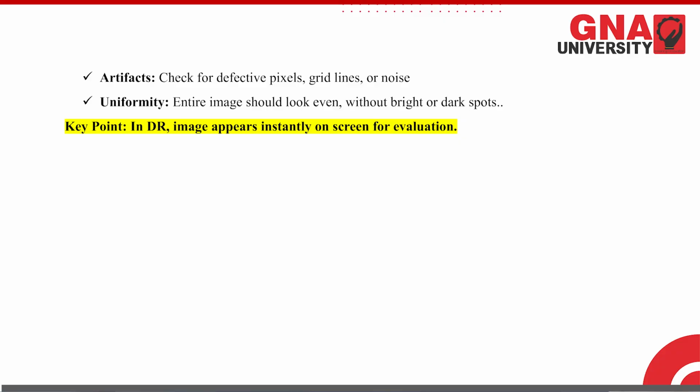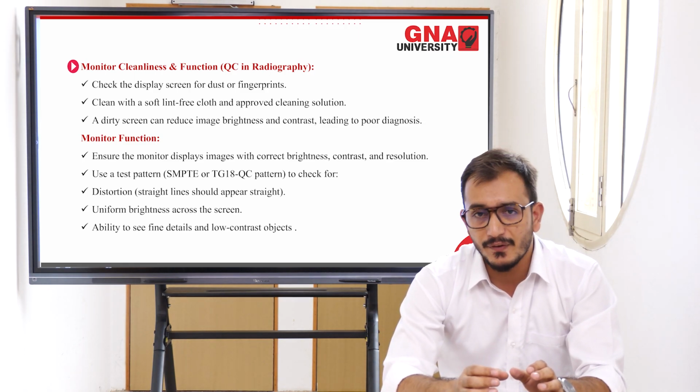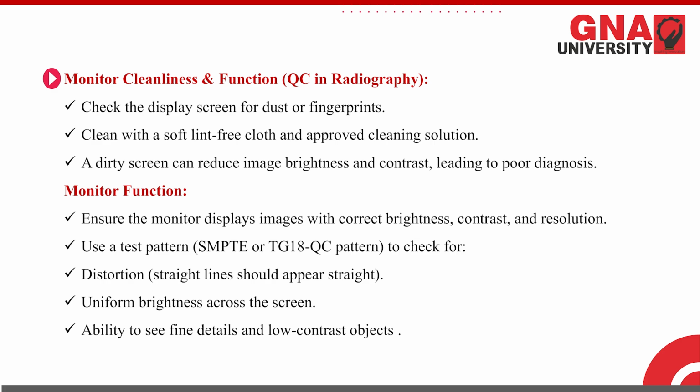And the next is monitor cleanness and functions. This is a test which we also perform on a daily basis upon the machine. Check the display screen for dust or fingerprints. We have to check the monitor by which we operate the machine, and check whether there is any dust or any fingerprints. If so, we have to clean it with a soft lint-free cloth or with various approved cleaning solutions.